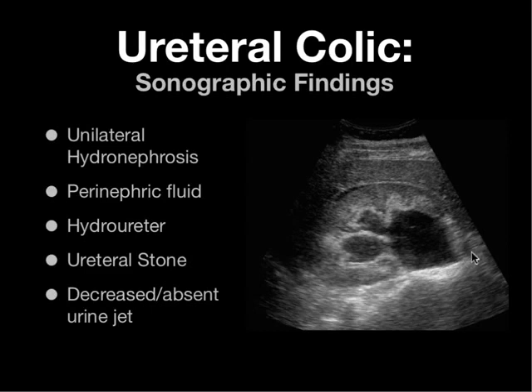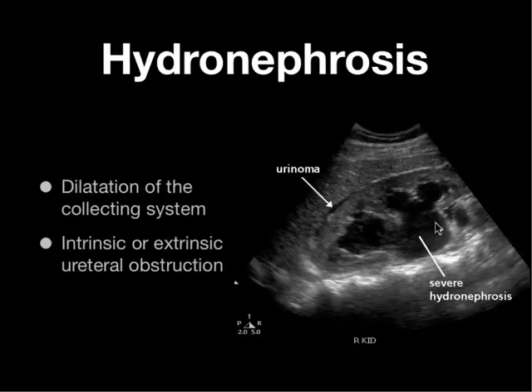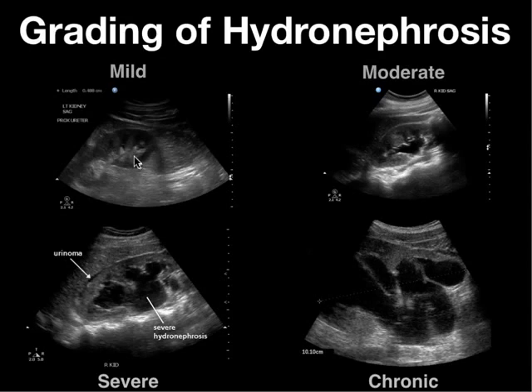Hydronephrosis is a dilatation of the collecting system. Make sure you can connect the minor into the major calyces into the pelvis so you're not confusing multiple renal cysts for hydronephrosis — confirm that all the tributaries connect. Remember this can be due to either intrinsic or extrinsic ureteral obstruction.